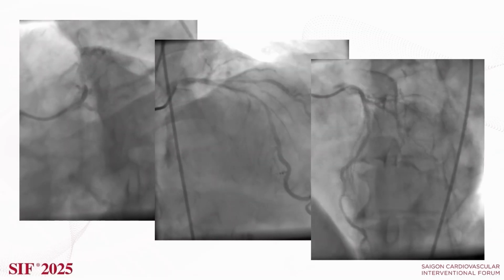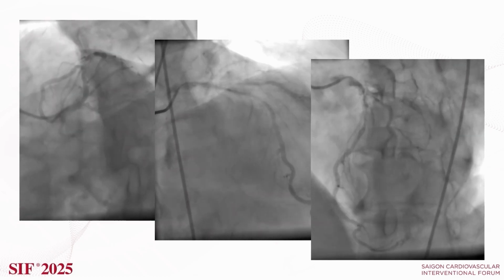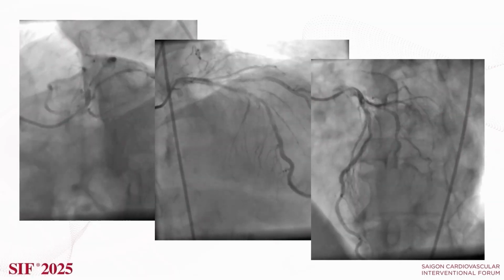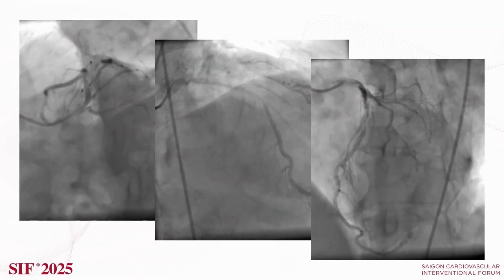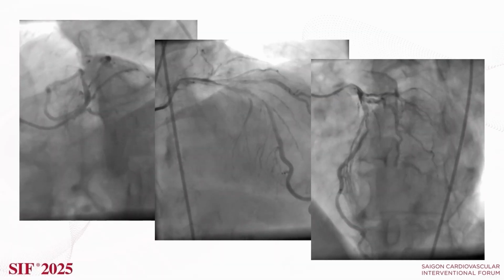So is there any comment from the floor? I think through the panelists, the people want to see the imaging of the LAD and diagonal, and especially the left main and the circ ostium, and see what is going on, and then we decide later.